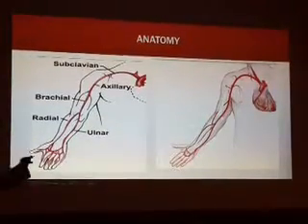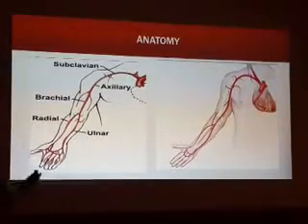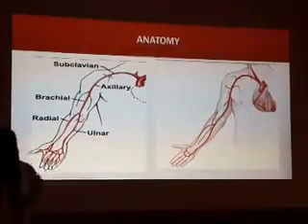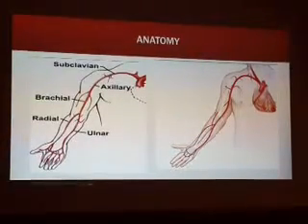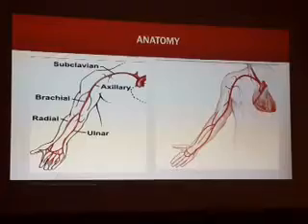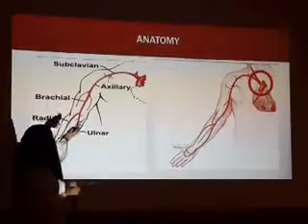The only thing you need to know is anatomy. Know your anatomy very well, and it will be easy, whether you are scanning upper or lower. They have the same concept but different anatomy. To know your anatomy very well, you need to know the origin of your vessel.